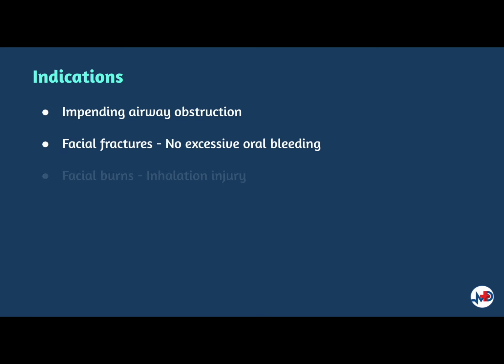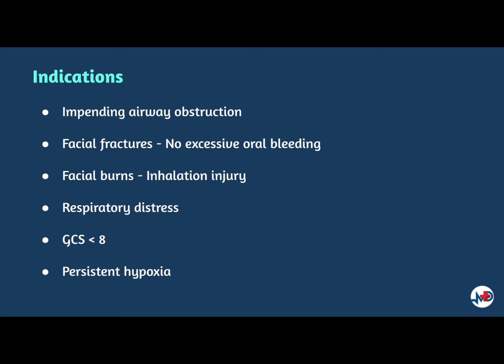So, endotracheal intubation is indicated to assist ventilation during a surgery or when a patient cannot protect their airway in the situation where their Glasgow Coma Scale is less than 8. This deems them high risk for aspiration. It is also indicated in patients who may have potential airway obstructions such as airway burns, epiglottitis, or neck hematoma, or in patients who have inadequate ventilation or oxygenation, as in cases of acute exacerbation of COPD, bronchial asthma, or ARDS.